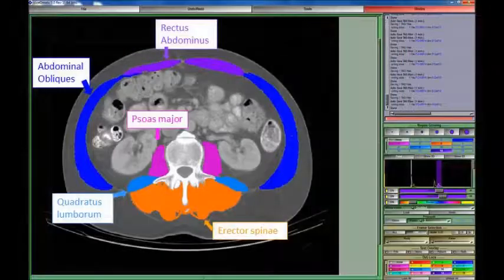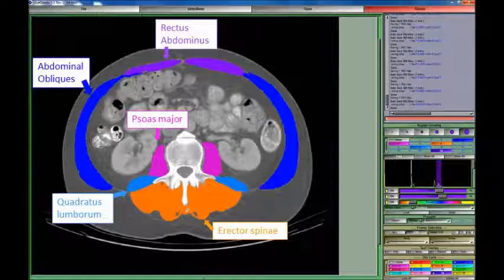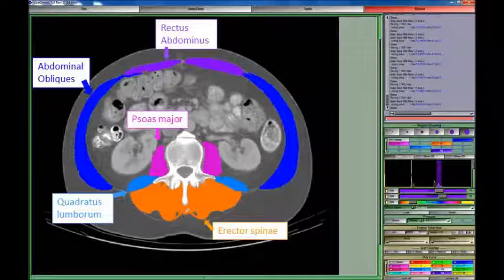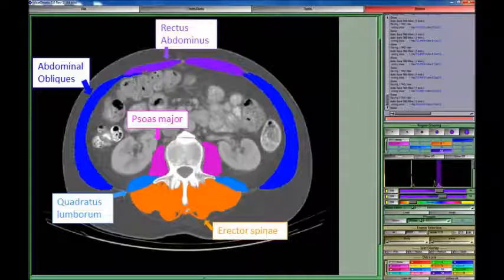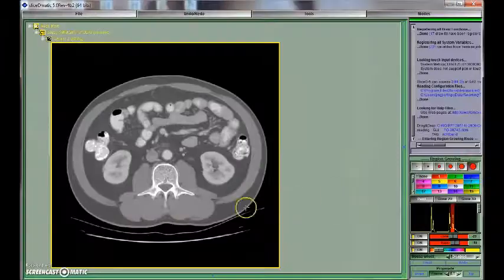It is also possible to color different muscle groups by setting different tag colors to each individual muscle group, although in this case we will only demonstrate the analysis of total skeletal muscle cross-sectional area.